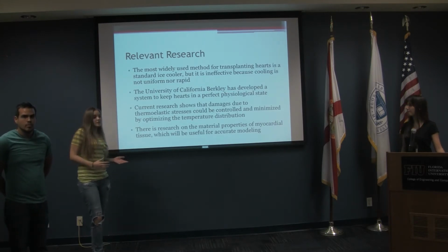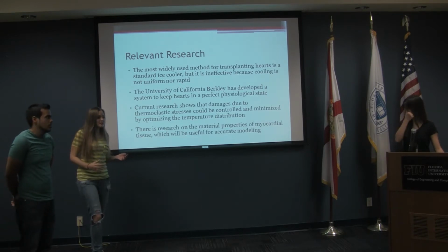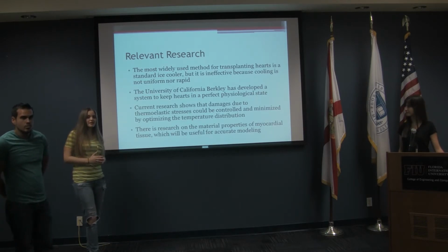We're taking a different route. We're going to cool the heart internally as well as externally. By optimizing the flow rate and temperature of the coolant through the heart, we should be able to reduce thermal stresses, which are a main factor in the decay of tissue.